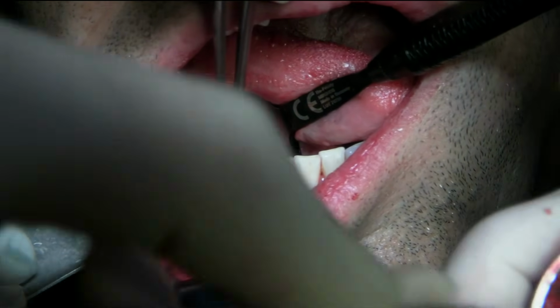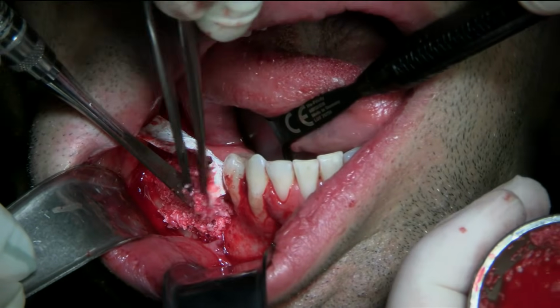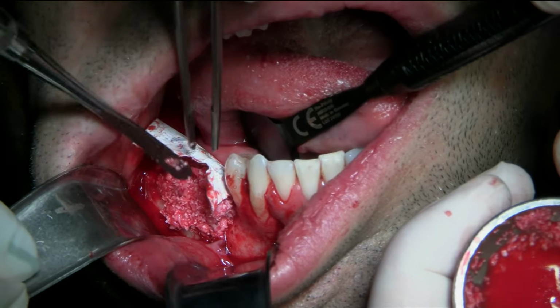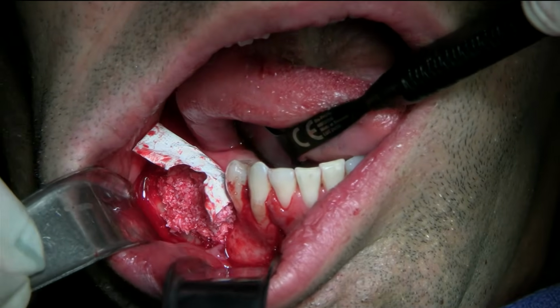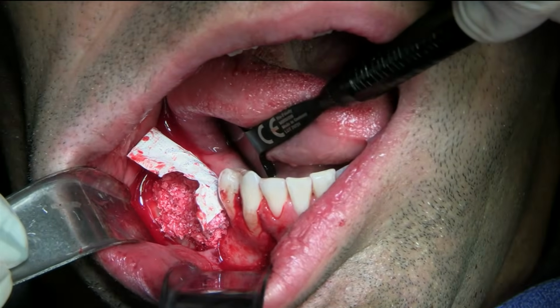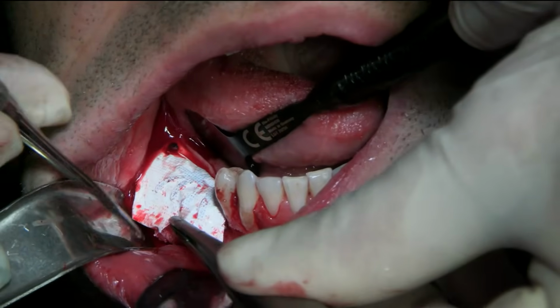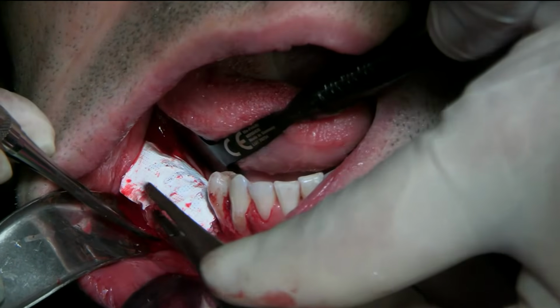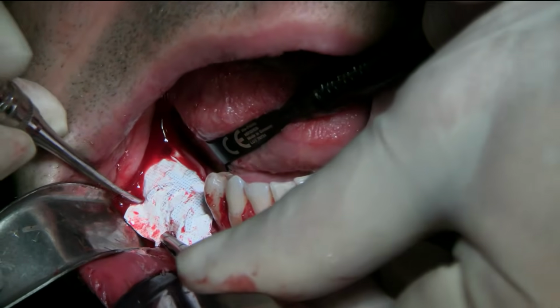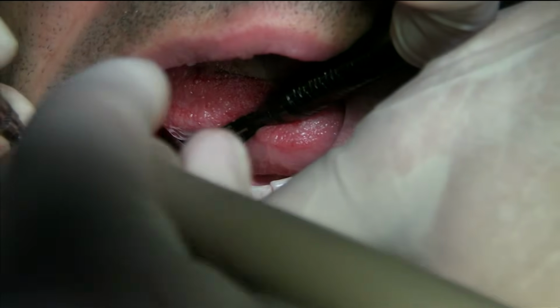A little bit of bone here in the front. Yeah, I used all my bone. Okay, so now I'm going to have to get a pin. Wait, let me just hold, stay like that. Put the membrane down. Yeah, okay, suction there, suction there. This way.